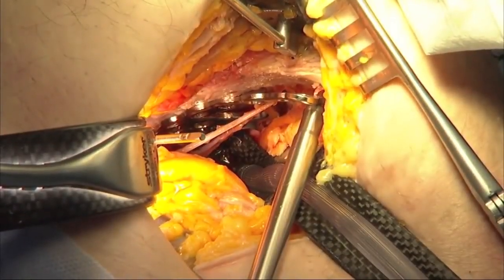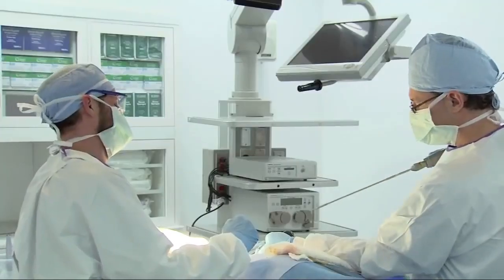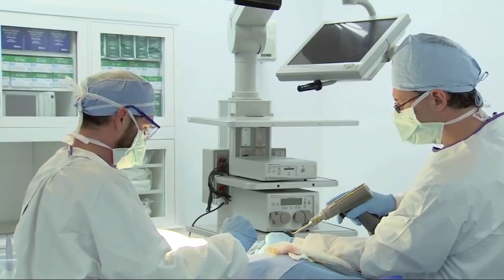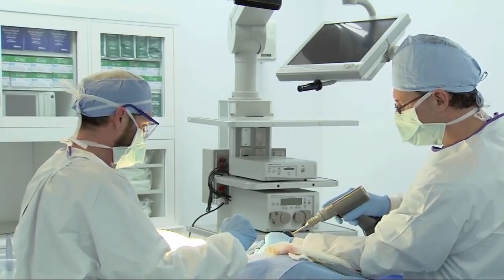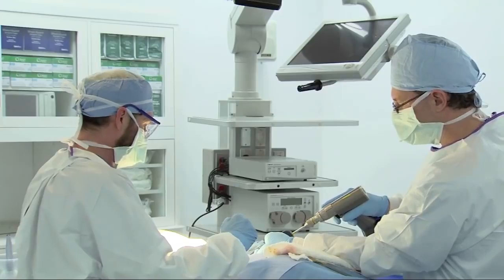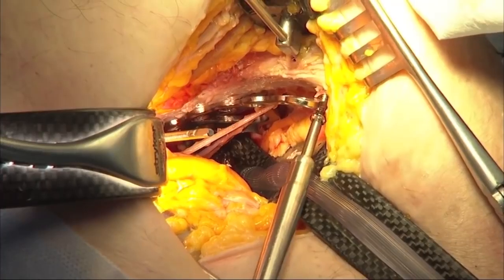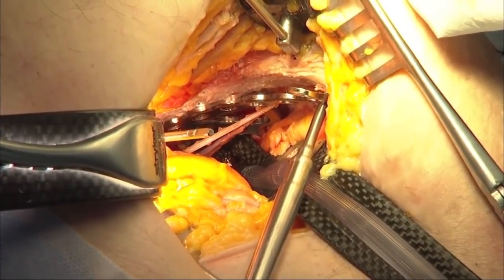Again, we can measure right off the drill bit with the graduations and the cannula. And we're going to drop our screw down the insertion handle, and we're going to screw it in just like the other two screws you saw previously. And remember not to go all the way with the plate screw insertion handle, but you can see how the screw will bring the plate down to the bone nicely for us.